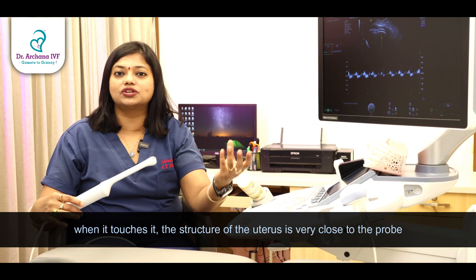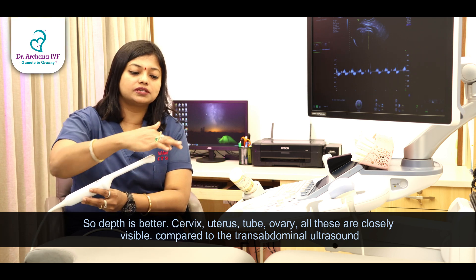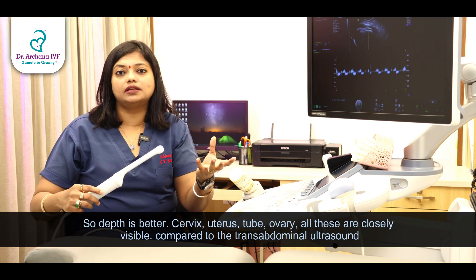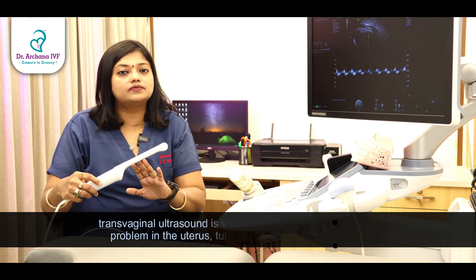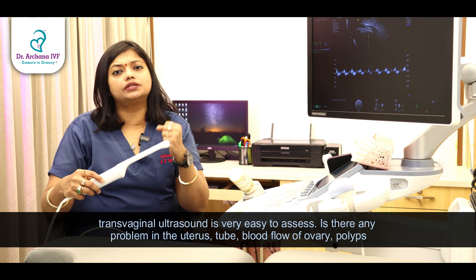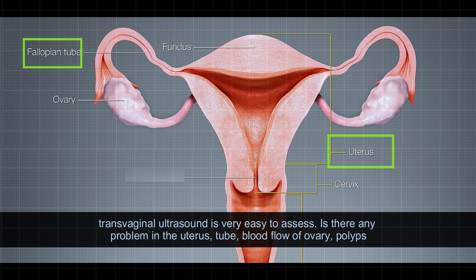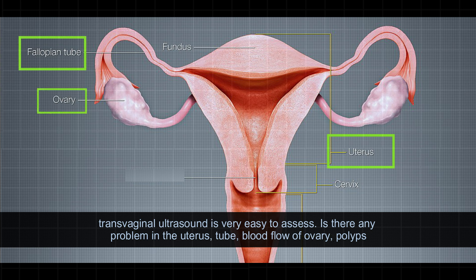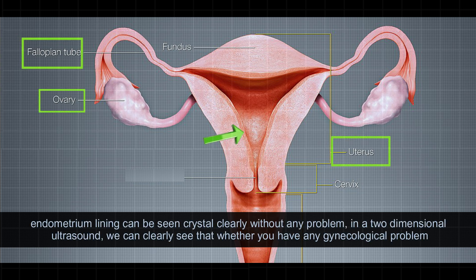It is very close. You can see the depth, the cervix, the uterus, the tube, the ovary — all very clearly. Compared to trans-abdominal ultrasound, with trans-vaginal ultrasound we can see the uterus, tube, ovary, polyp, endometrium, and the lining — crystal clear.